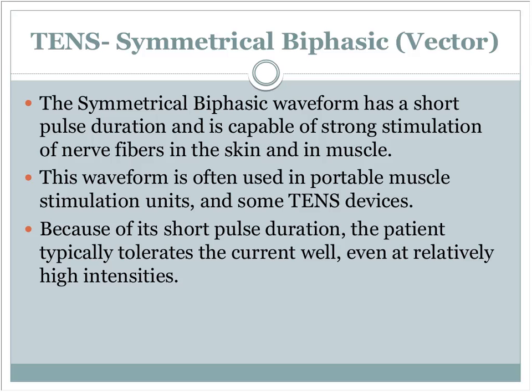premodulated setting will actually do the same type of treatment as TENS. TENS, it's not really a brand name, but it's almost reached that point. It's like saying a Kleenex when you're talking about tissues. The TENS effect can be delivered through different waveforms, and we'll talk about that in a minute. But in this case, when you have the symmetrical biphasic, it means that it's two phases, positive and negative, and those two parts are symmetrical in size and shape.